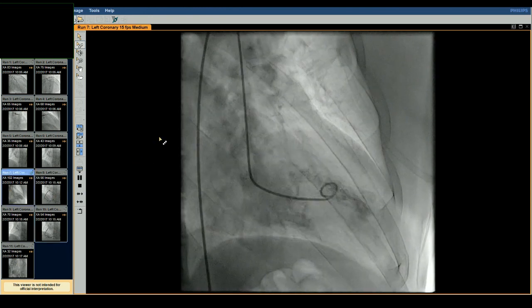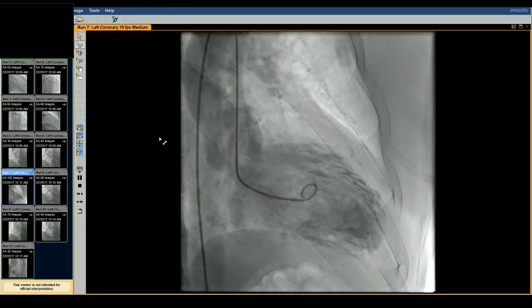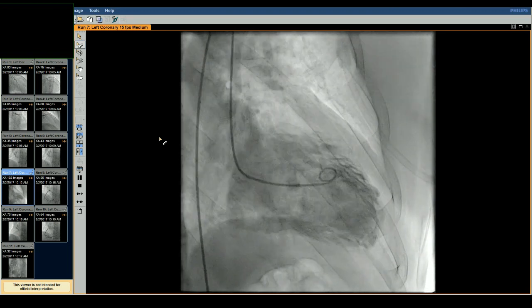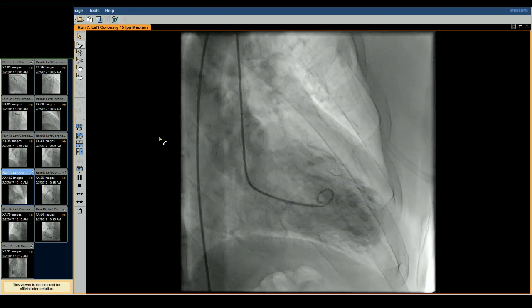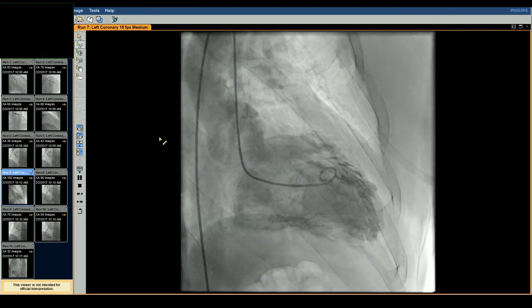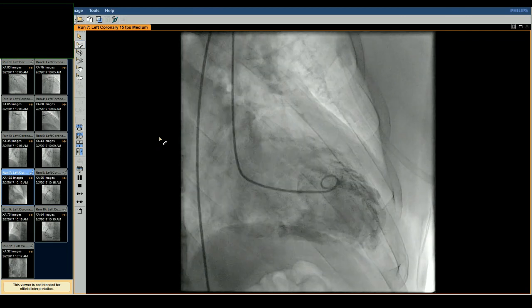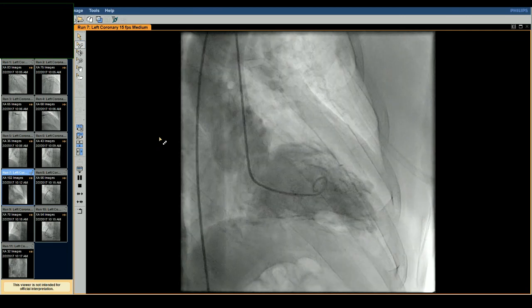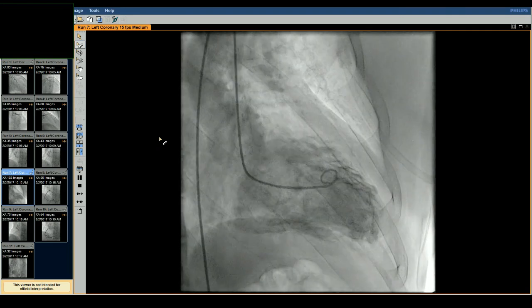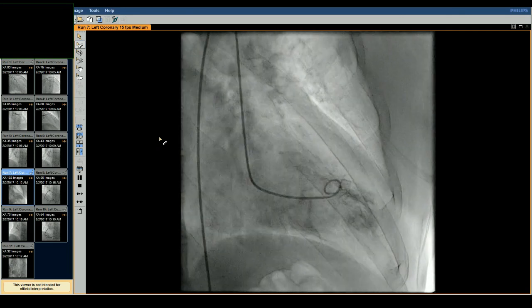Left ventriculogram, and so it doesn't look normal. There's that little bulging area, the anterior lateral wall. That doesn't look normal. The apex doesn't squeeze normally. The posterior basilar area doesn't squeeze normally. The anterior wall's moving pretty well. So there are some things wrong with this ventricle. I'm not sure why we see what we see. There's a little distortion there, like a little diverticulum of the anterior wall.